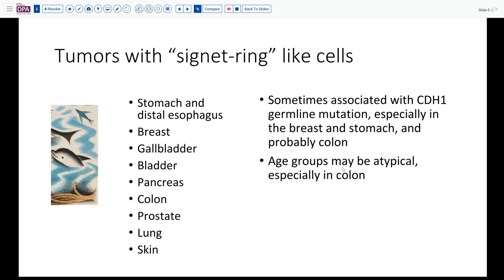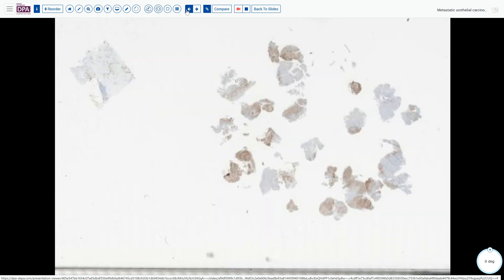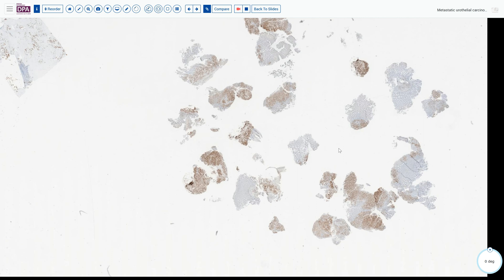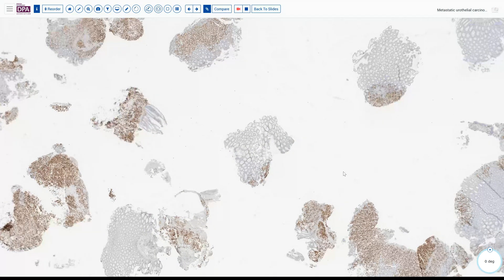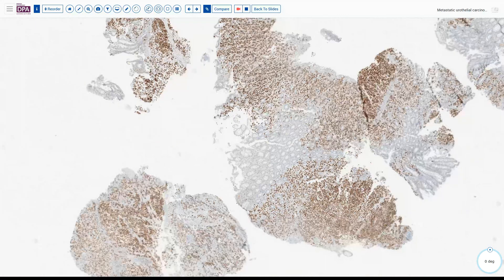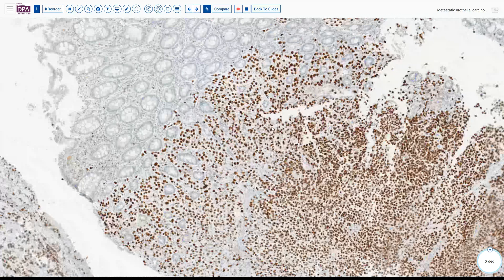Our patient is much older, so probably not in that category, but it's worth considering. Further investigation is warranted, including review of the patient's history. In fact, this patient has a history of a prior malignancy involving the upper urinary tract. Here is a stain and as you can see, it is strongly positive in all of the tumor cells — this is a GATA3 stain.